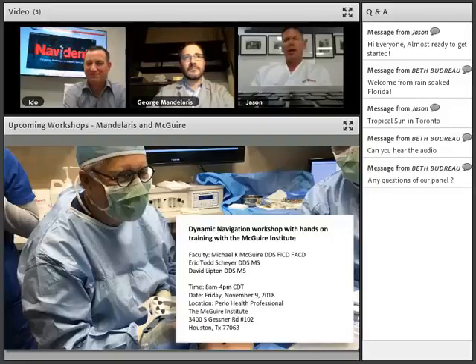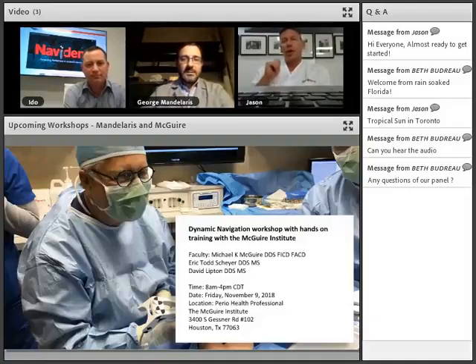One thing, George, just while we're talking, some people love using the head tracker for maxillary cases. Sylvia, for instance, is one who would prefer to use the jaw tracker, same as for the mandible, in the maxilla. Do you see yourself, I know you haven't done that yet, do you see any advantage in that for you?